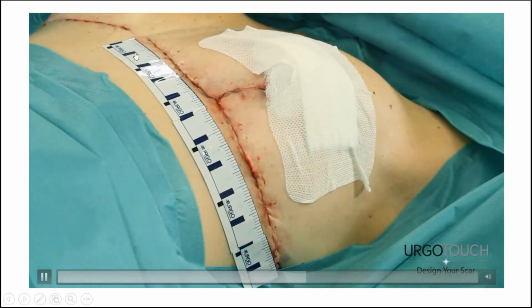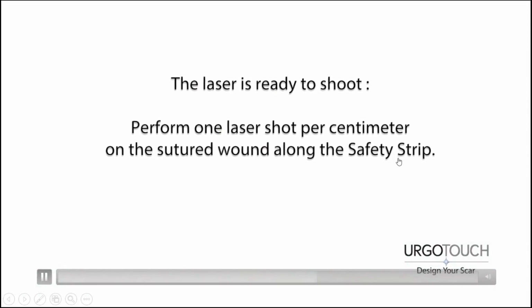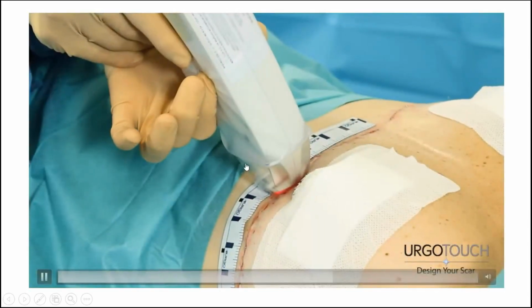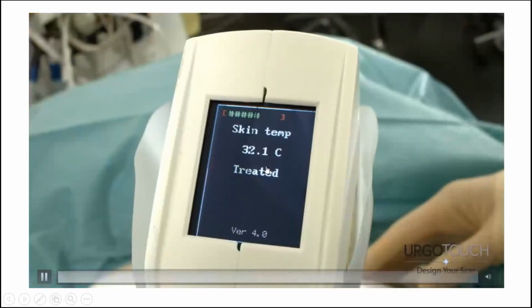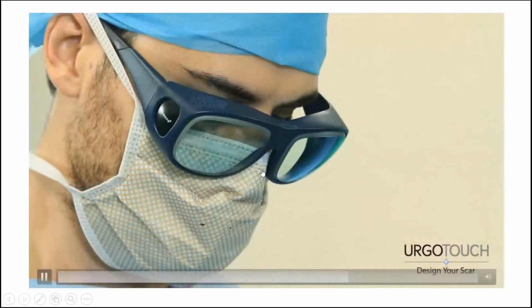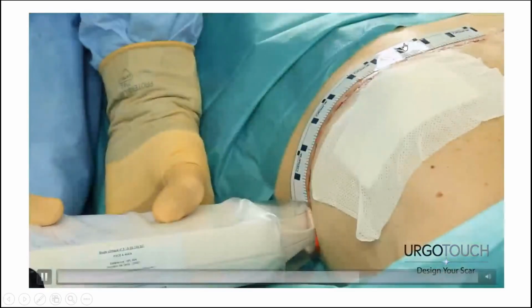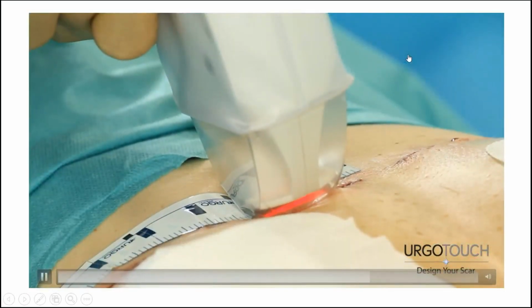in fact, this part, and he has to apply the laser in contact with the safety strip, where there is an exchange of data, for example, the parameters. And when it's treated, it stops automatically and is able to move to another zone. It will be unable to treat, to go back, because the strip is deactivated.